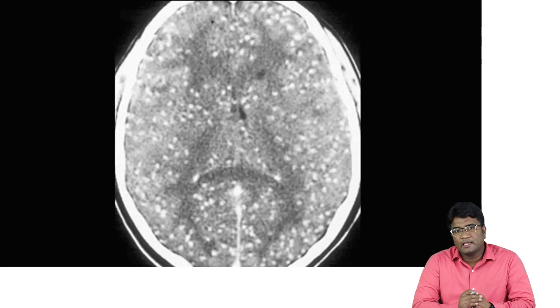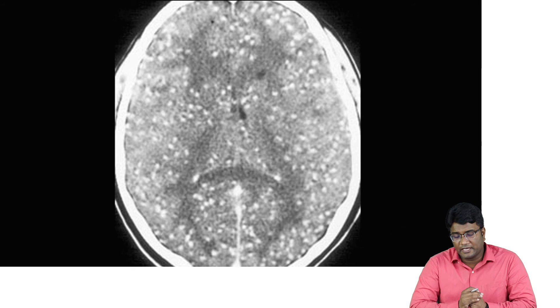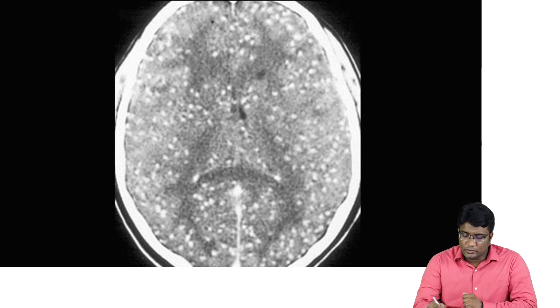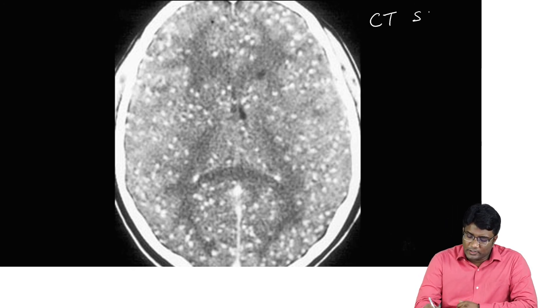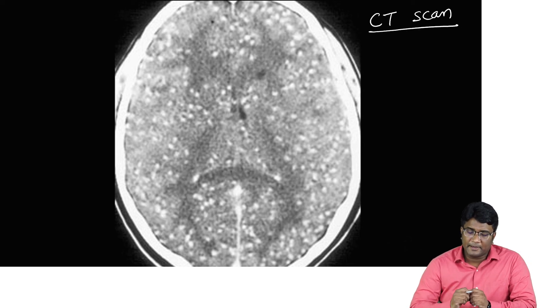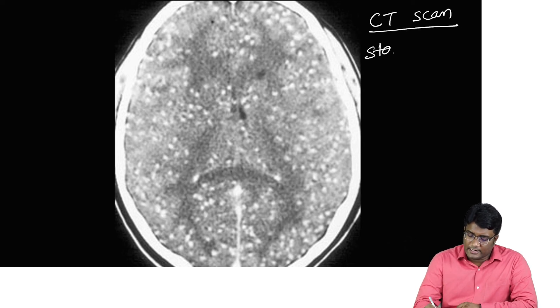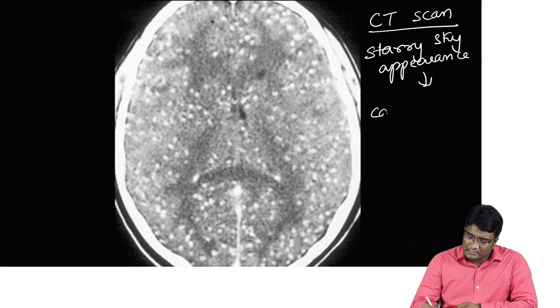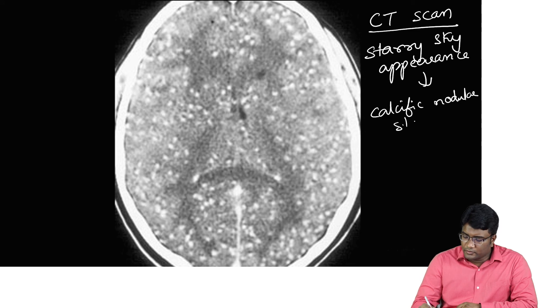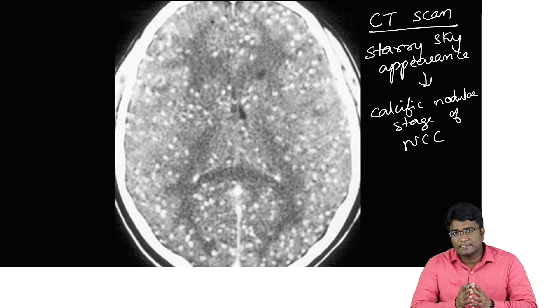This image is a CT scan showing multiple calcifications noted throughout the brain parenchyma. This CT appearance of multiple calcifications throughout the brain parenchyma is called the starry sky appearance. The starry sky appearance is a classic feature of the calcific nodular stage of neurocysticercosis.